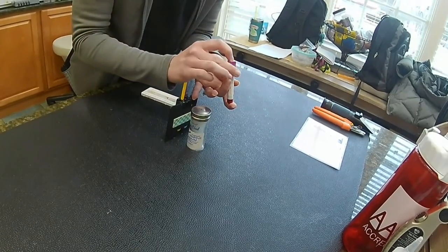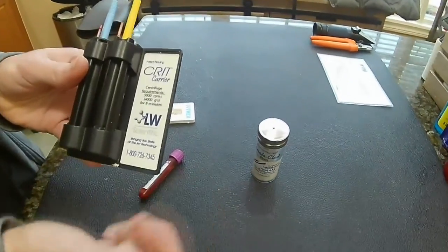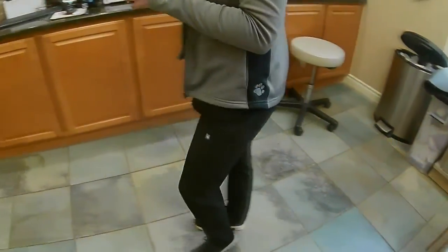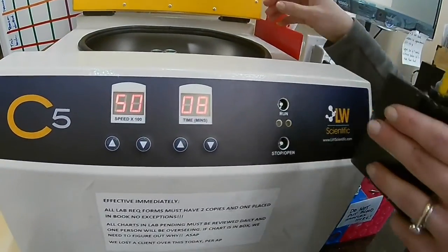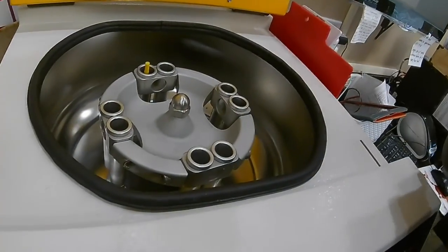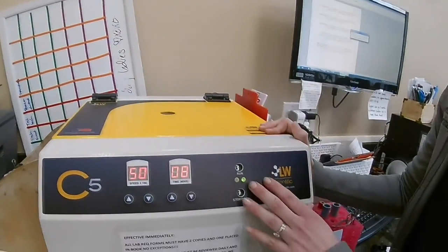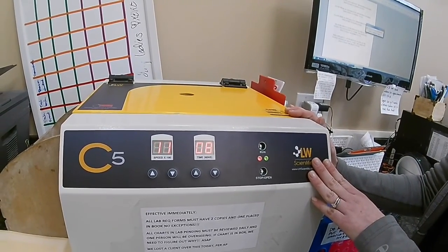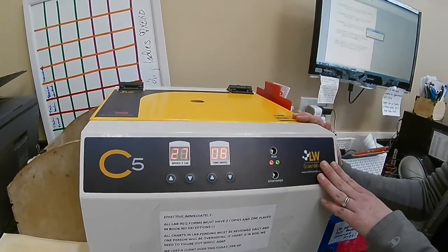So we have to use an adapter for our centrifuge to spin these down. The recommendations that come with it are to spin at 5,000 RPMs for about 8 minutes. So we're going to get that loaded in here. And I already have that set right here, so we got our speed and our time. I'm double checking nothing else is in here. And just set these in as such, balancing that. Make sure we're running smoothly. All right, and we'll be back in 8 minutes.